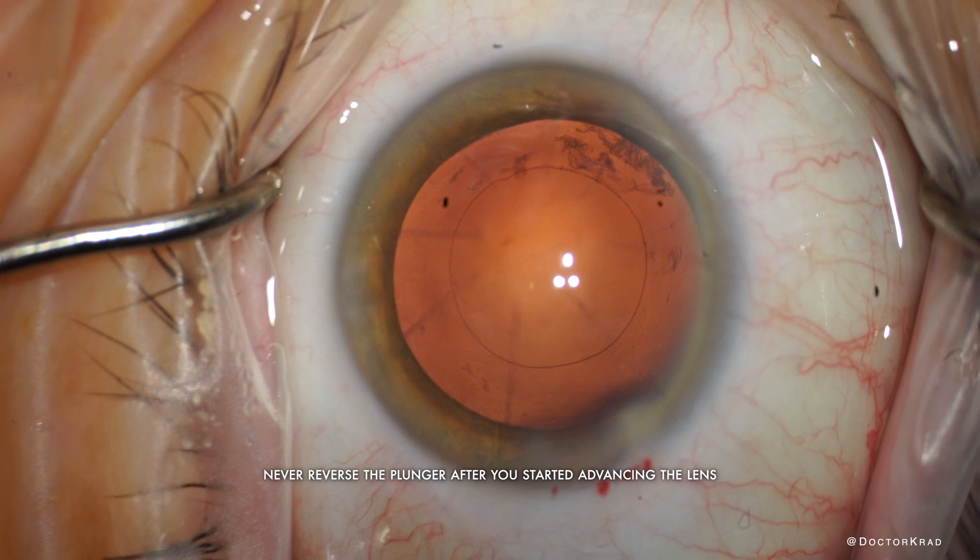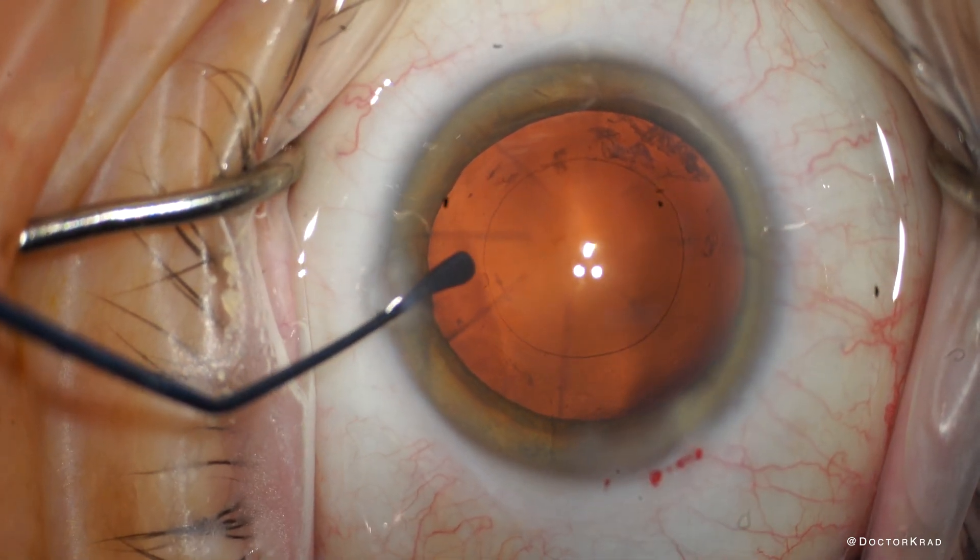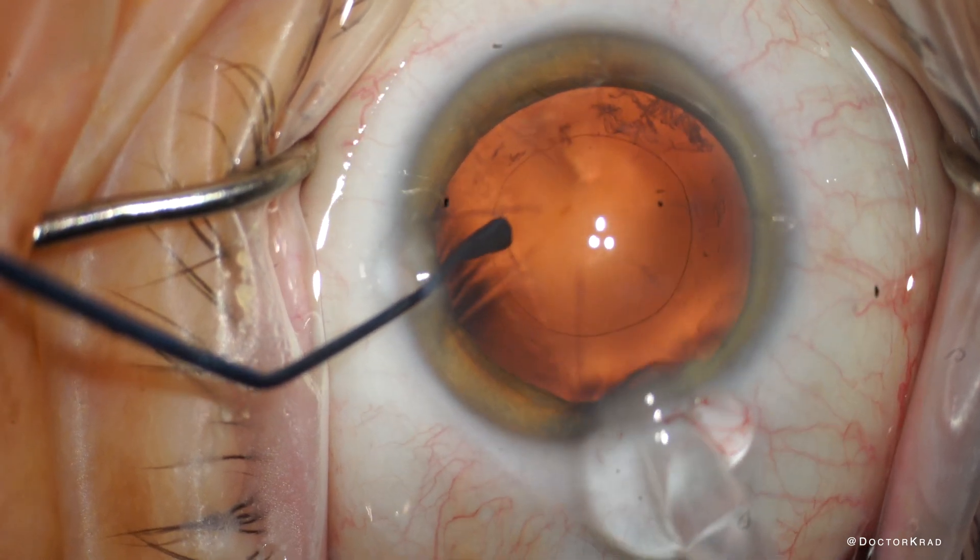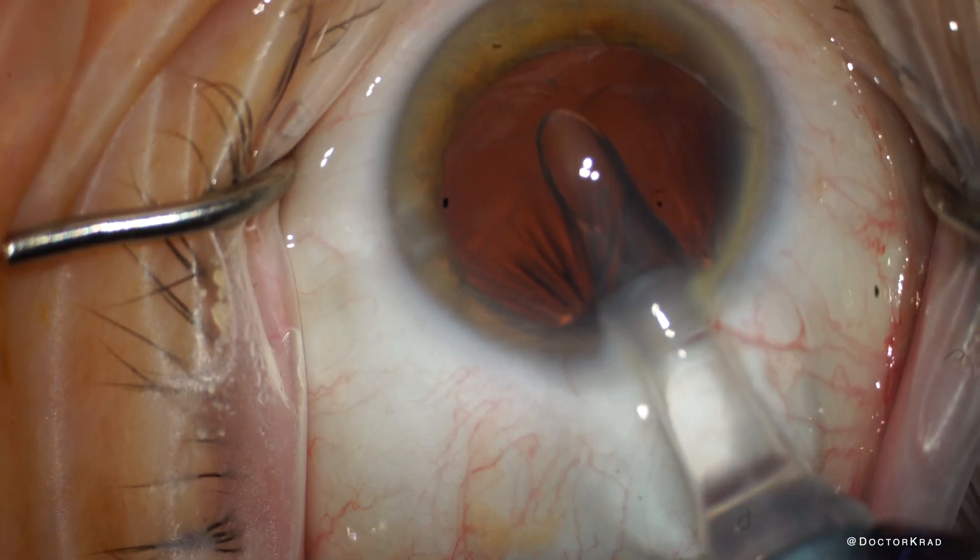Okay, so it looks like we are ready. Let's take it to the eye. I use the second instrument for counter traction. And then we're going to place the injector through the incision. Make sure that the notch of the injector passes the capsulorexis and iris.